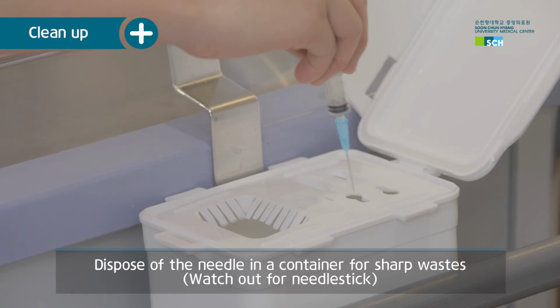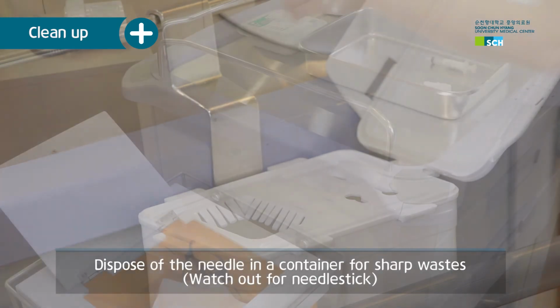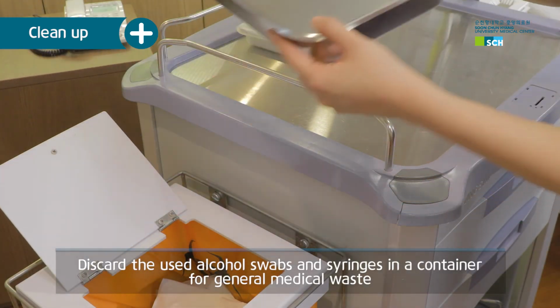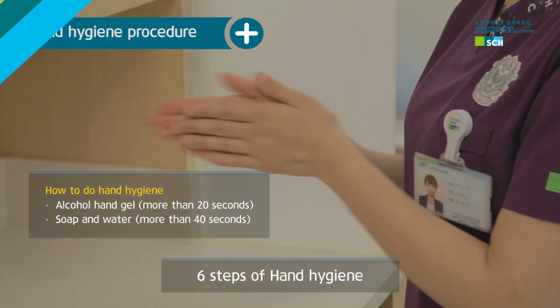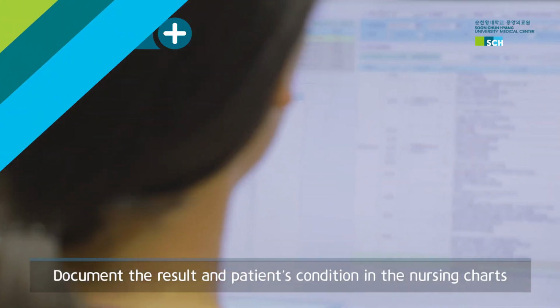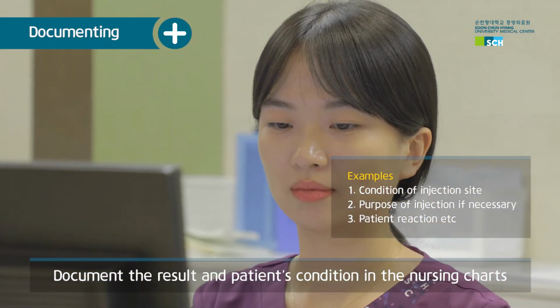Clean up the used equipment. Do not recap the needle. Dispose of the needle in a container for sharp wastes. And discard the used alcohol swabs and syringe in a container for general medical waste. Perform hand hygiene. Document the result and patient's condition in the nursing charts.